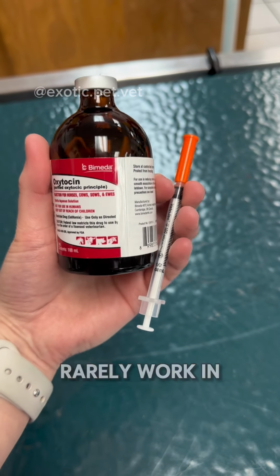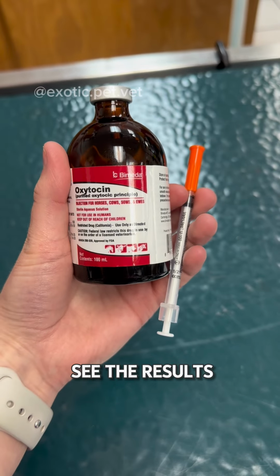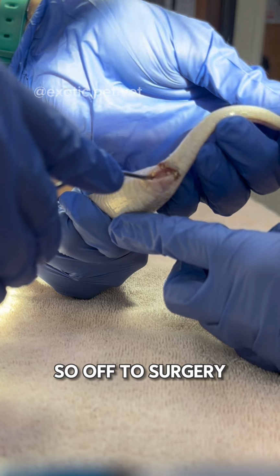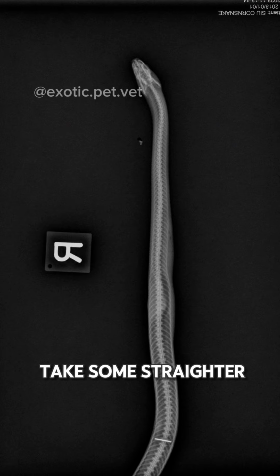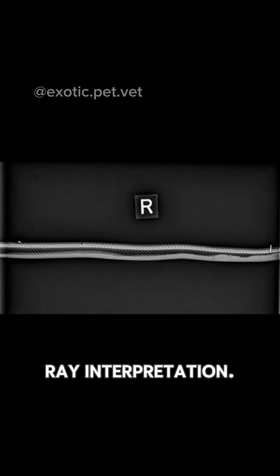Calcium and oxytocin rarely work in snakes, but it was worth a shot. But not surprisingly though, we did not see the results we wanted. We were not able to access the egg through her vent, so off to surgery she went. While she was becoming sedated after her injections, we decided to take some straighter x-rays. Be sure to see my other video for more information on x-ray interpretation.